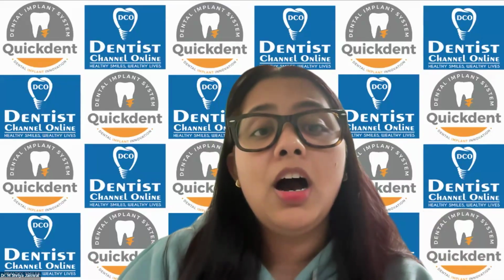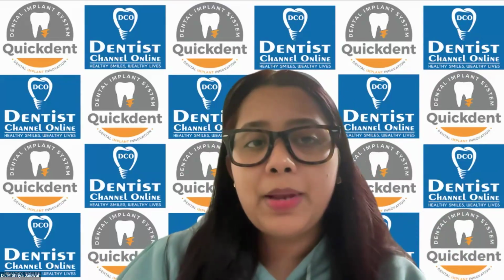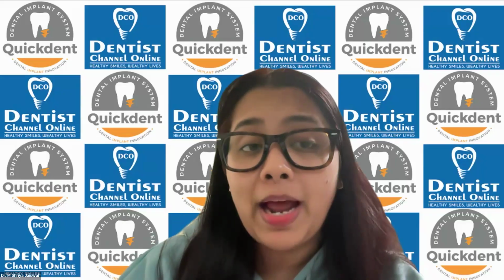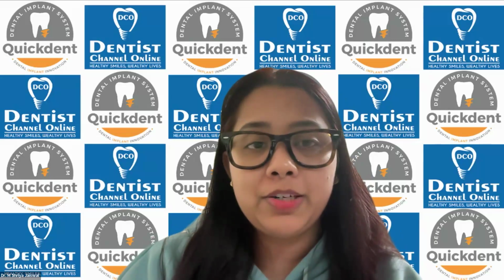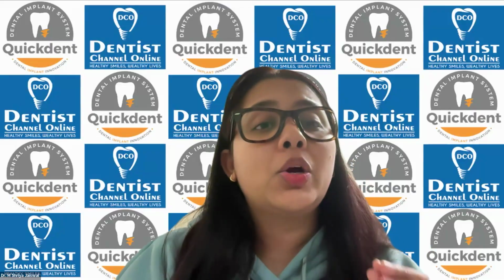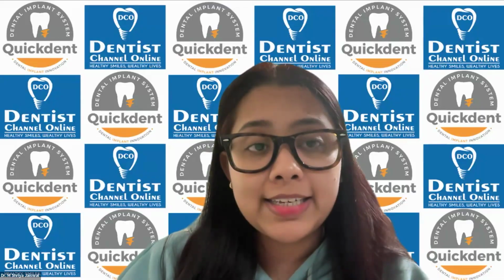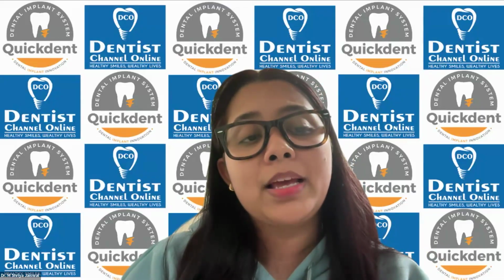So now, without any delay, let's talk about the topic of today's session, which is principles of flap design around dental implants. So basically, the success of dental implant placement relies not only on precise implant positioning, but also on careful soft tissue management. One of the key aspects of this process is flap design, which plays a crucial role in ensuring adequate surgical access, preserving blood supply, and promoting optimal healing.